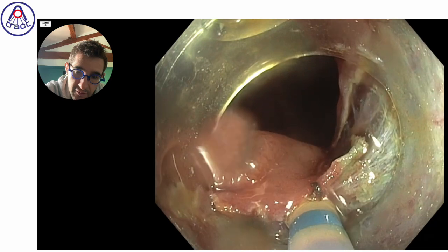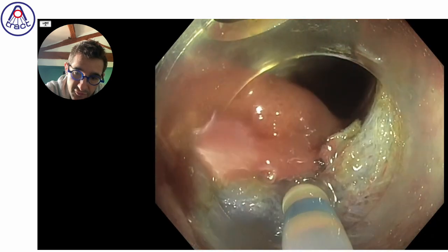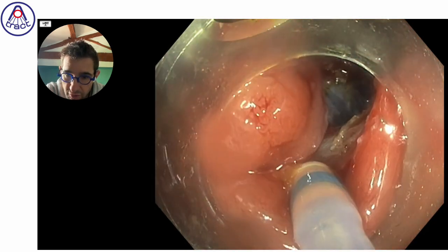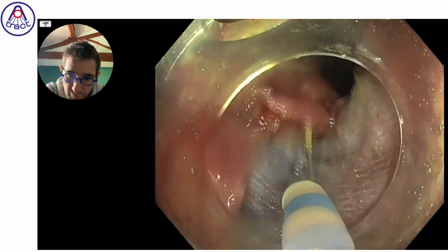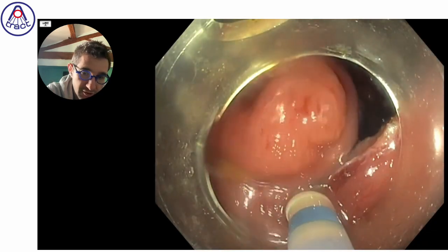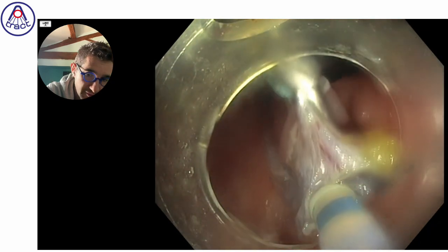from the specimen. So here, you should be aware that if I go straight, I can damage the margin of the lesion. So I should go to the right and open more the space. It's the problem when the lesion is turning, a kind of torquing is present, and you have a small risk of damaging the specimen.